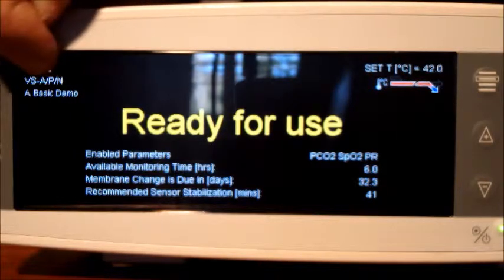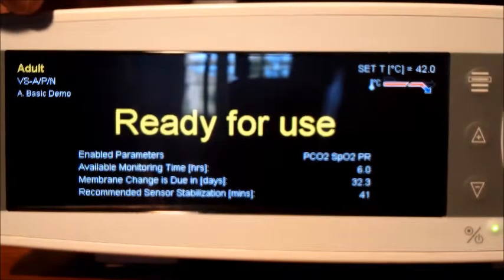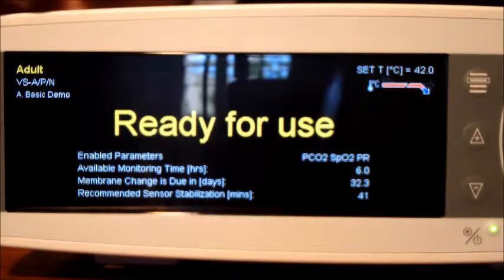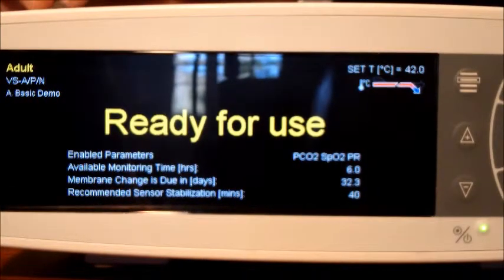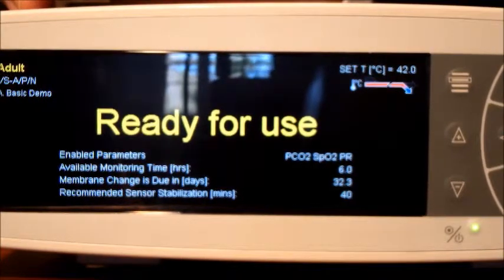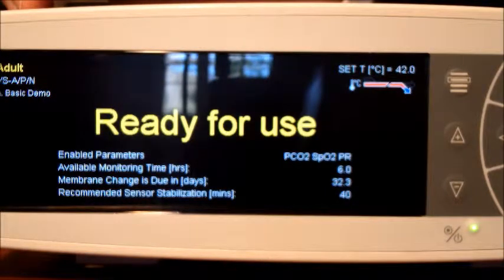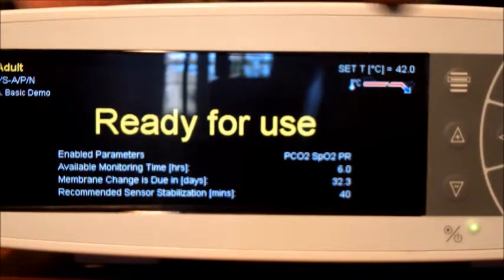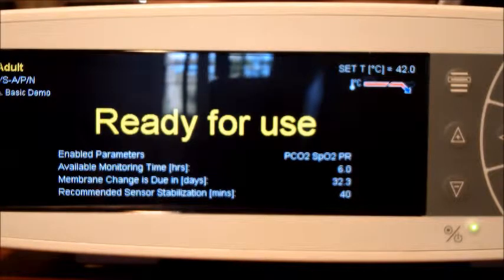You can also check the profile the machine is set to. This one's set to basic with demonstration mode activated. If someone has changed the profile or a setting on the device that's not in keeping with the profile, you'll get a screen asking whether you want to continue with the changed setting or go back to the set profile. This one's fully set up - we've got membranes, monitoring time, and it's ready to put on a patient.